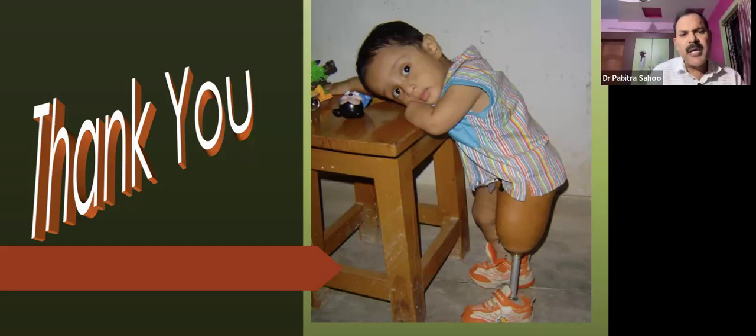The base socket for a long prosthesis, if you go for advanced form, all advanced sockets are ischial containment sockets. So in ischial containment sockets, many designs are coming up now. There may be a soft socket inside, a soft liner, and outside a hard socket, and many modifications can be done with the ischial containment socket. So whatever the length of the stump, the ischial containment socket is always better. But in places where the facility for ischial containment socket preparation is not there, long stumps can best work with a quadrilateral socket.